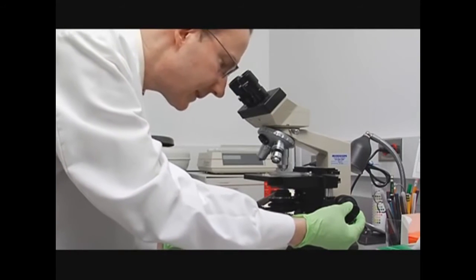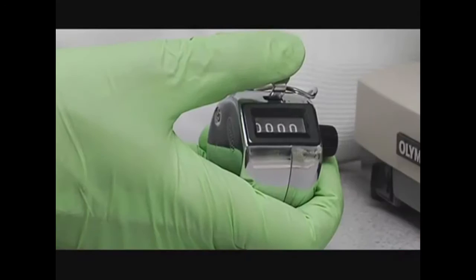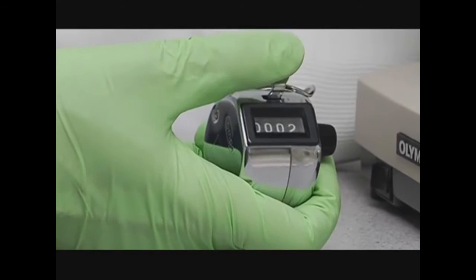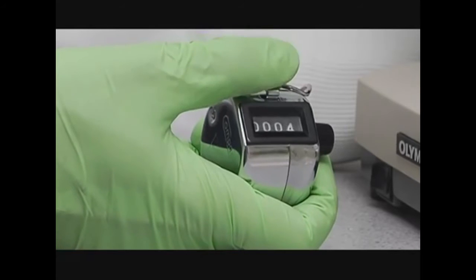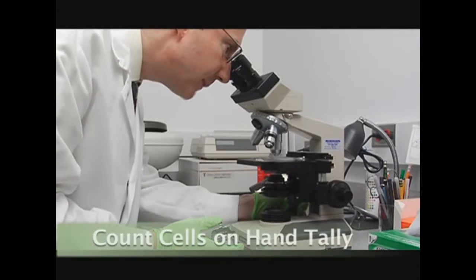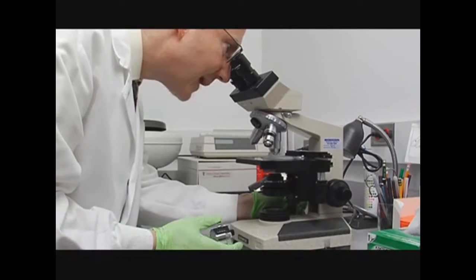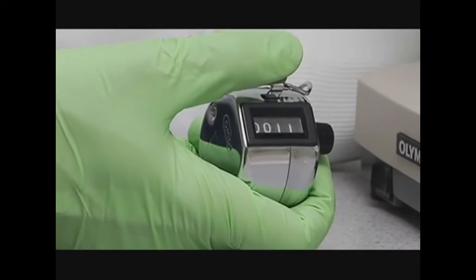Then as you count the cells, you'll keep track of them on a hand tally like this. And you probably need to fine focus as you count the platelets. They'll show up as dark or bright little spots in the hemocytometer, and as you find each cell, just click it on the hand tally like this.